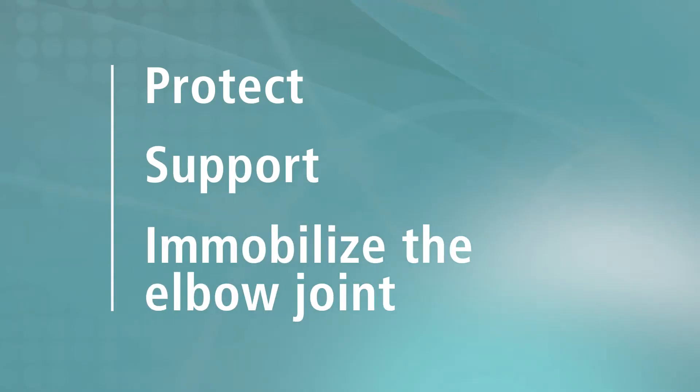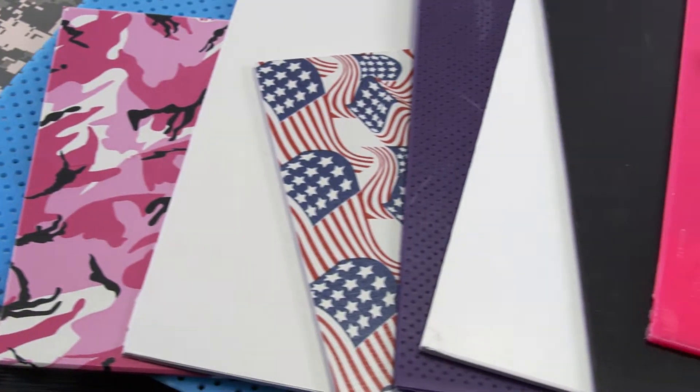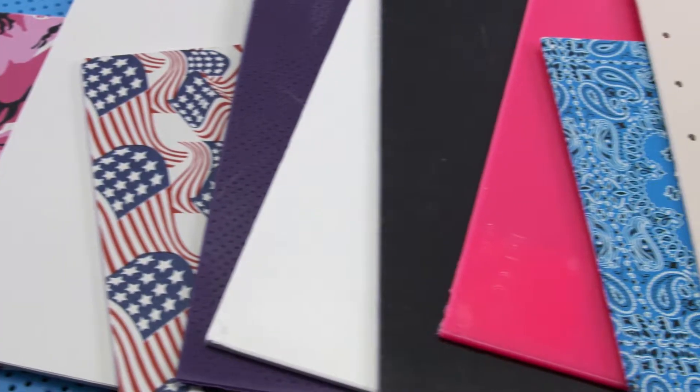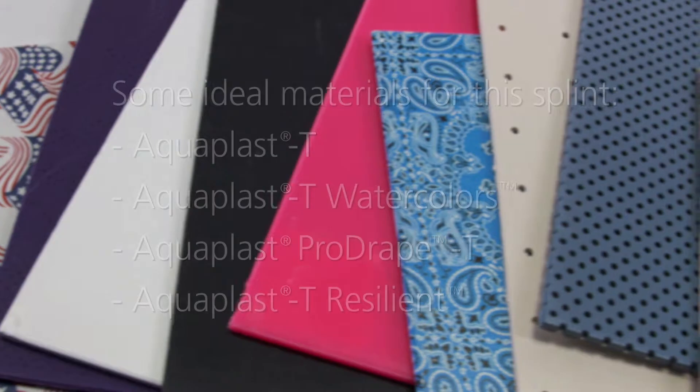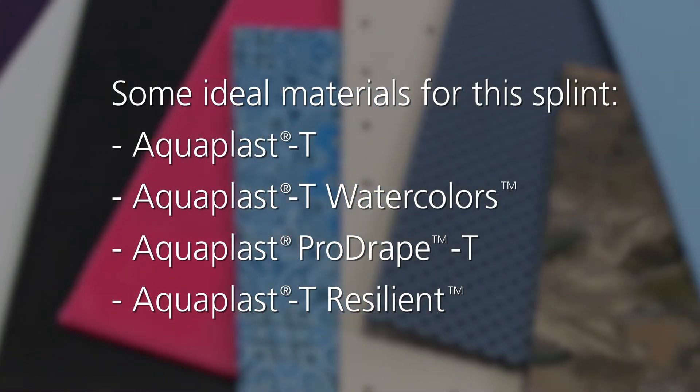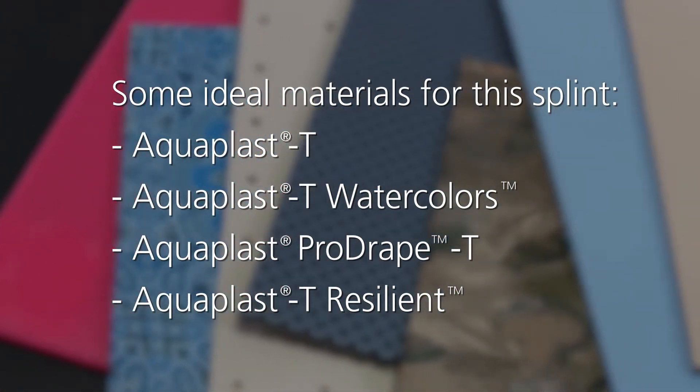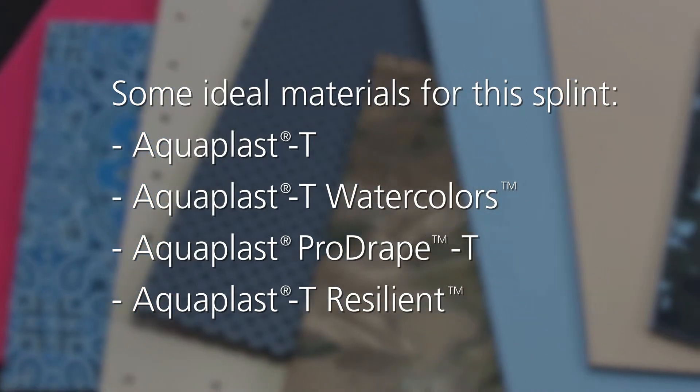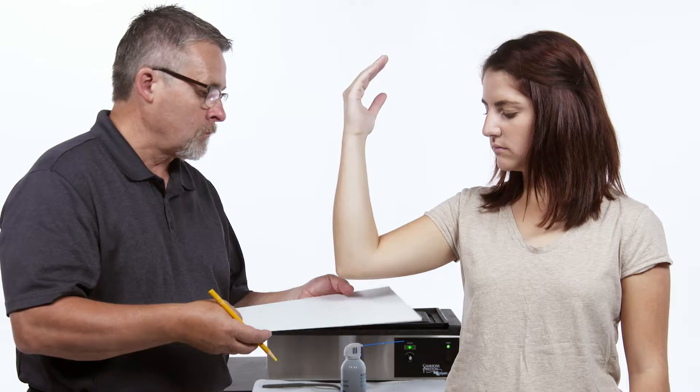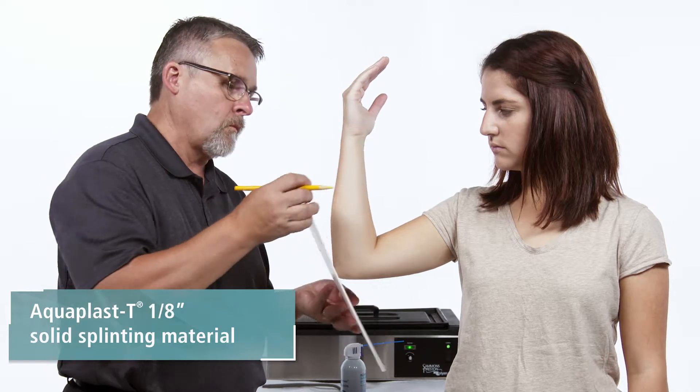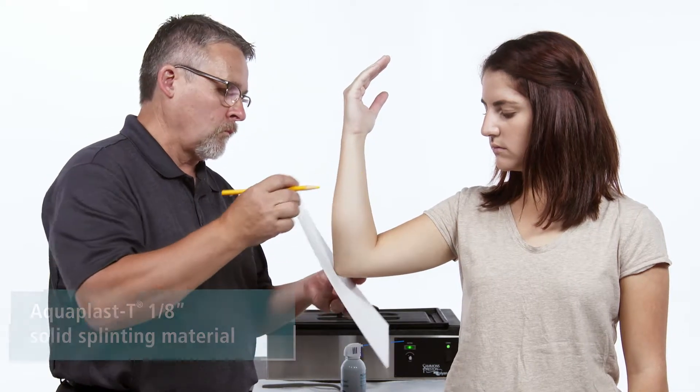This orthotic is used to protect, support and or immobilize the elbow joint. Rolion has a material for every splint, every therapist and every experience level. This demonstration will be showing the stretch and pinch technique which works best with materials from the aquaplast family. Today we will be using 1 eighth inch aquaplast T solid splinting material.